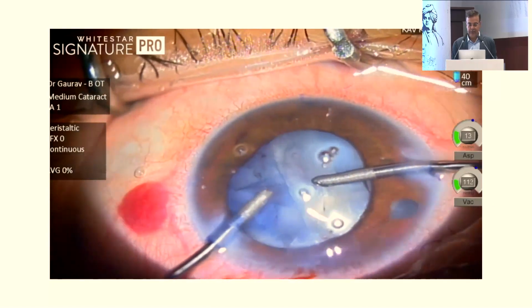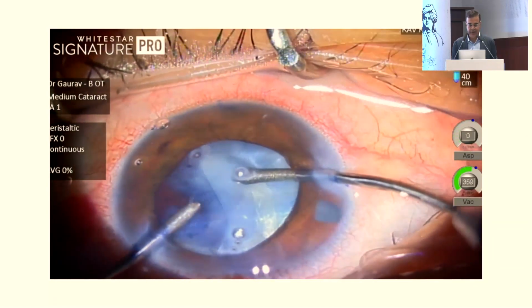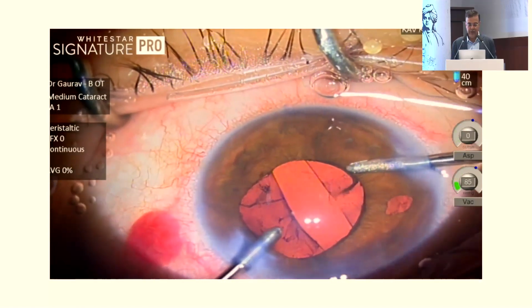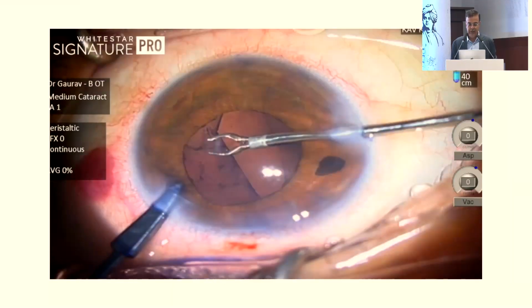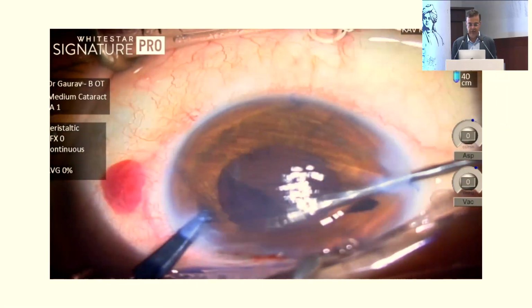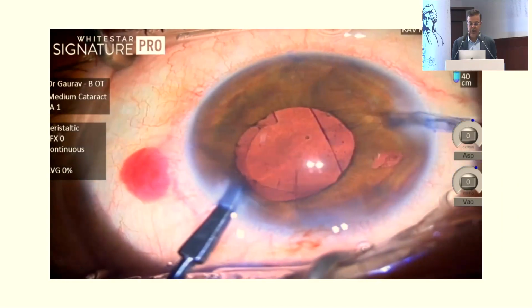And now, of course, you have to do the best. It's a soft cataract. It's a young patient, she's about 35. And now you can convert this into a rhexis. And of course, then you have to fashion a rhexis out of that. There forms one side and the other side, and then you can complete the surgery. But how can you preempt this?